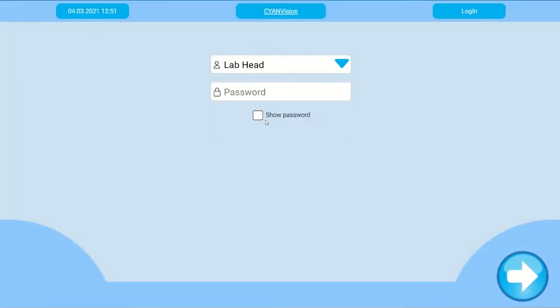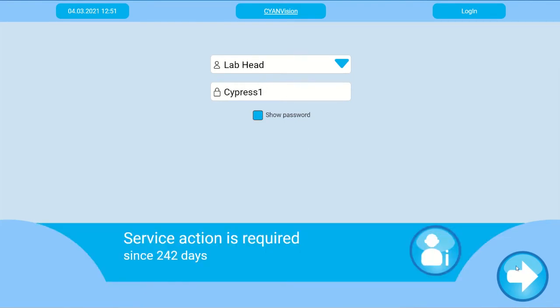Switch on the analyzer. Select the username 'labhead' and insert the password 'cypress1' to log in — mind the capital. A service popup will appear. This is a default message for all new analyzers. Now you must perform a washing, a pump calibration, and an AutoZero. At this point, a service engineer can also reset all the timers.